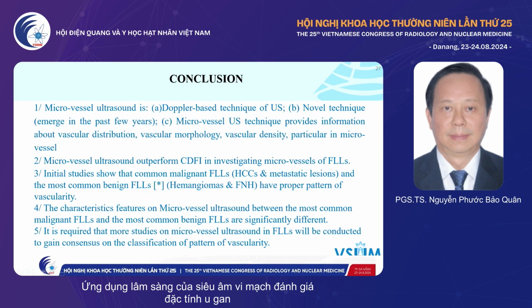So for conclusion, we suggest that this technique of microvascular ultrasound, a Doppler-based and novel technique, is very helpful to investigate the microvessels, their distribution, morphology, and density.